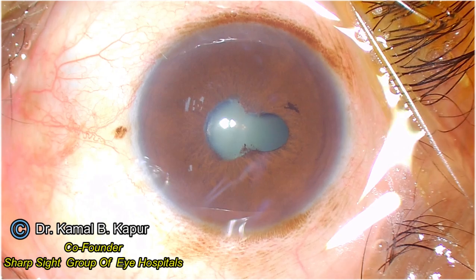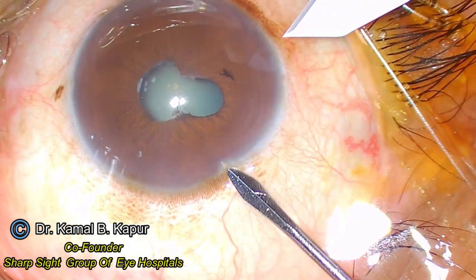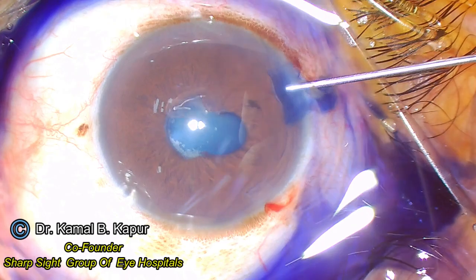This is a video in a series of simple tricks. Here we have a patient which is a non-dilating pupil, fixed with posterior synechiae and a fibrotic pupillary membrane with a floppy iris. This is a small fixed pupil.